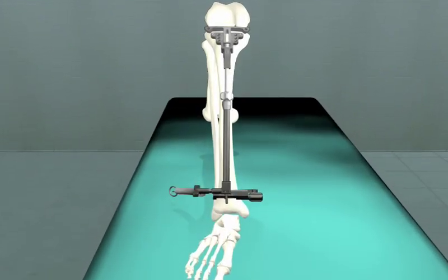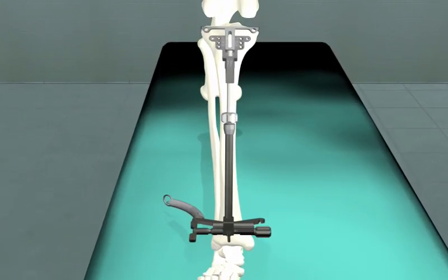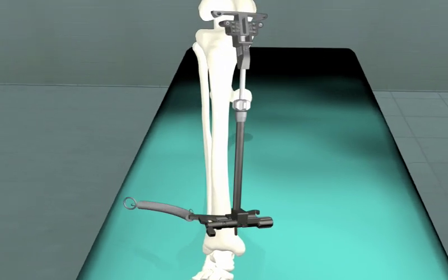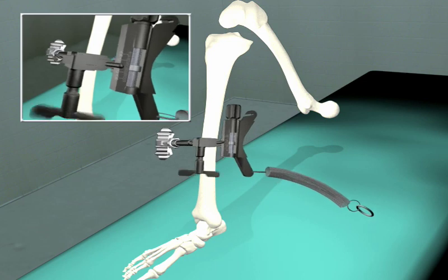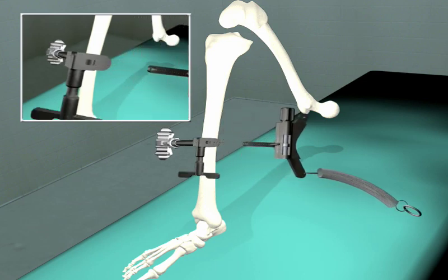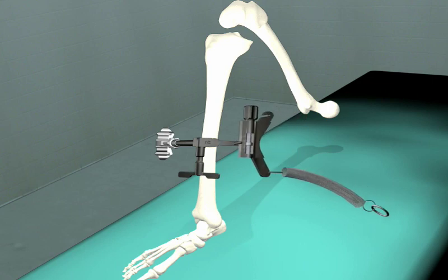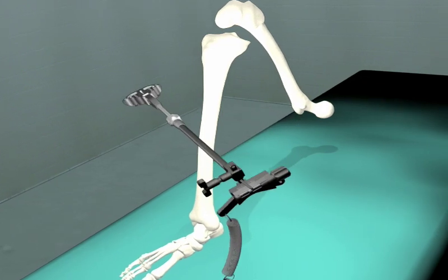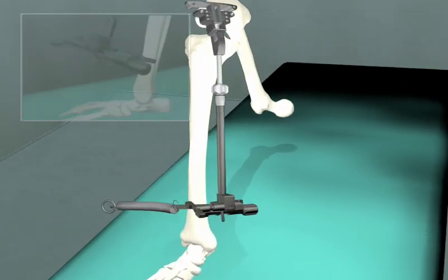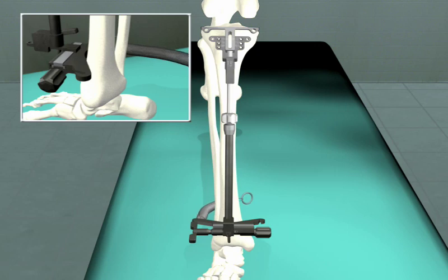Tibial resection requires the frontal plane alignment of the tibial resection guide to be perpendicular in the AP plane. This tibial resection guide is inclined posteriorly and is using a distal strap that connects to the ankle.